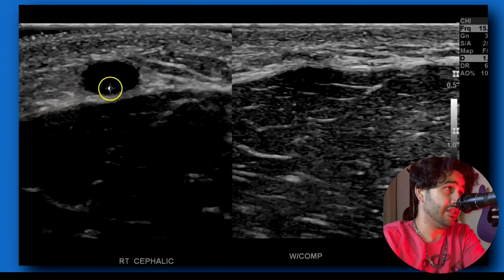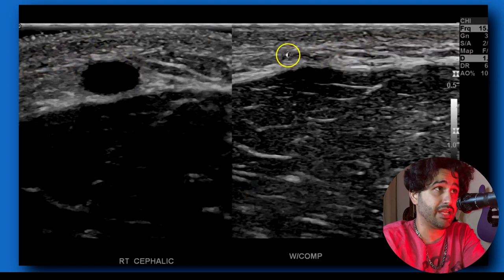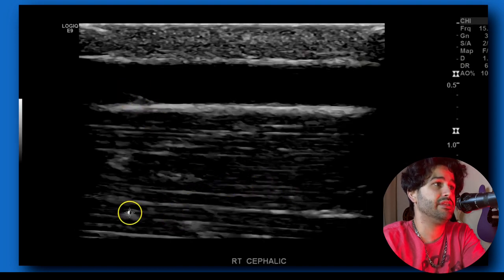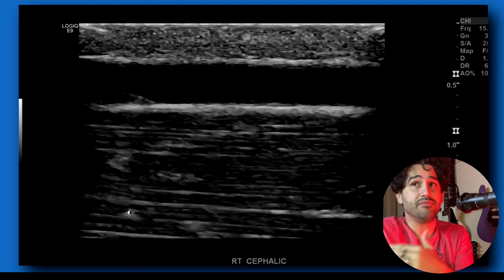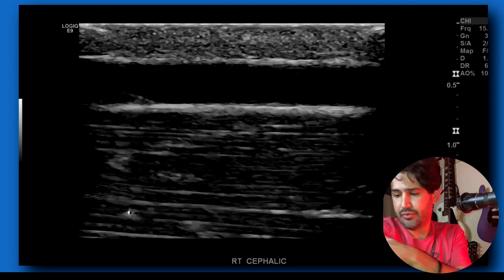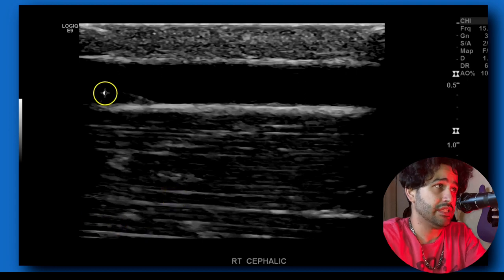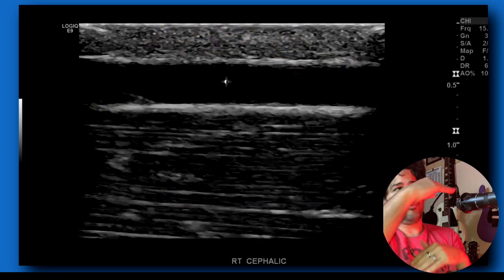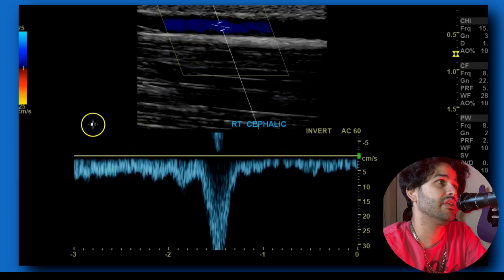Here's the cephalic vein — you can see it's very superficial, with muscle here and subcutaneous adipose tissue here. Collapsed — dual screen with compression. Longitudinal: you can see a little valve leaflet there with the bicep nearby. When you're doing the cephalic vein, you have to press very softly, because any light pressure might already collapse it. It's one of those veins that is very small, and in older people or if someone's had a lot of lines, that vein could be obliterated — you might see little collaterals. Use light pressure and extra gel. Tilt your transducer to give it more angle to get a good doppler signal. Take color doppler image, then spectral doppler.